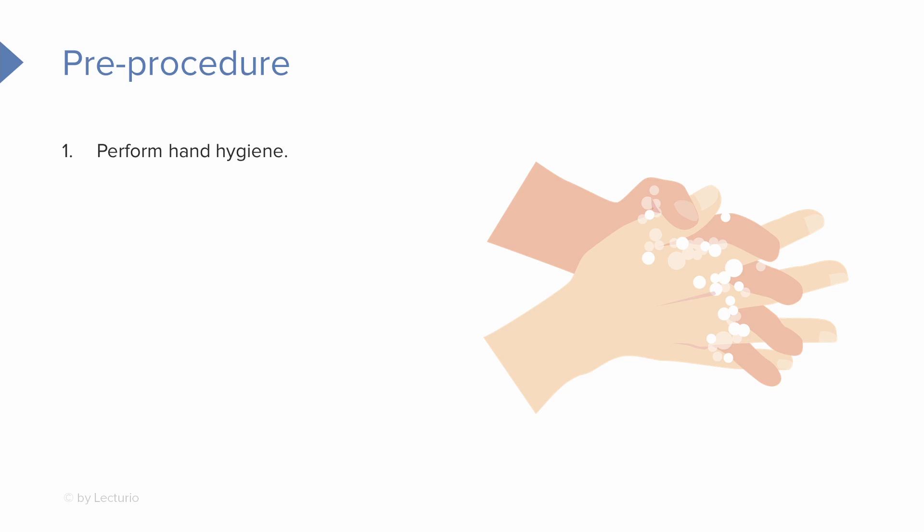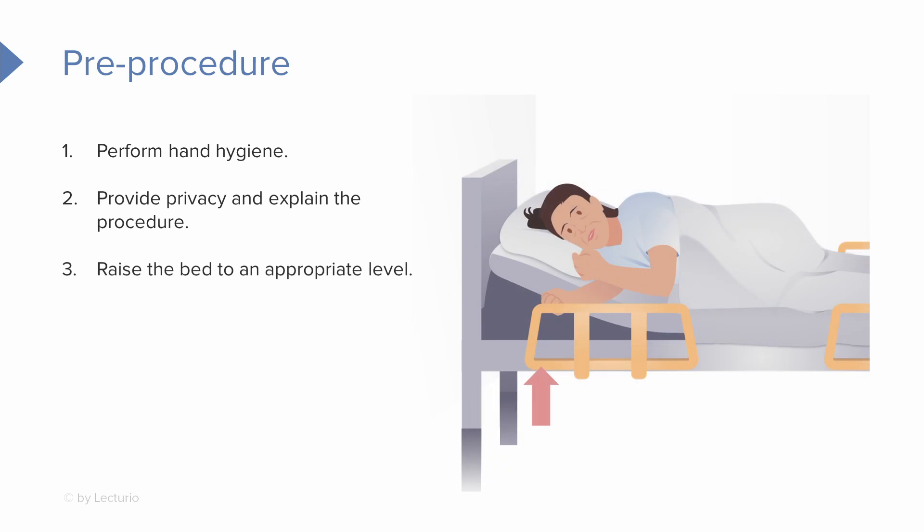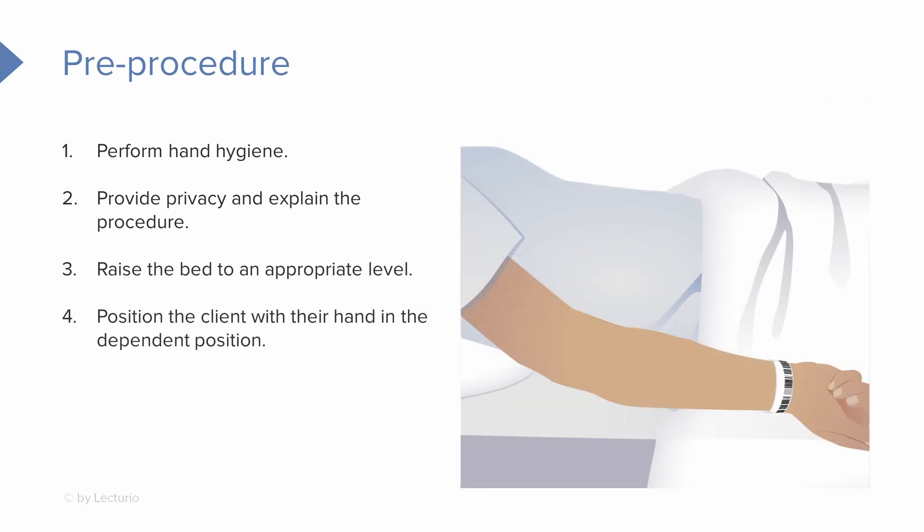Before we get started, perform hand hygiene, provide privacy, and explain the procedure to the patient. Raise the bed to an appropriate working height, then position the client with their hand in a dependent position.